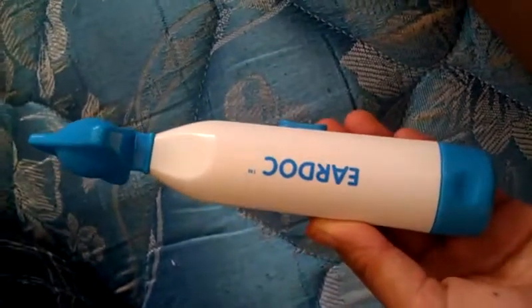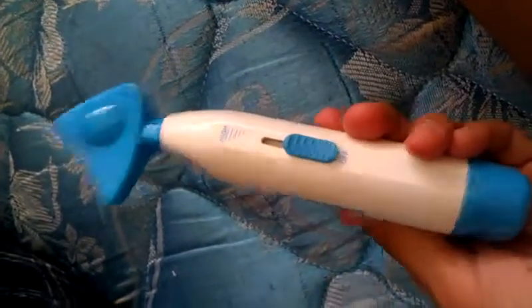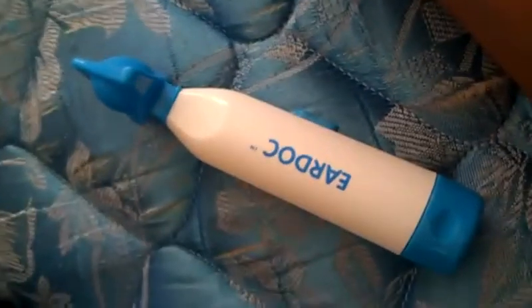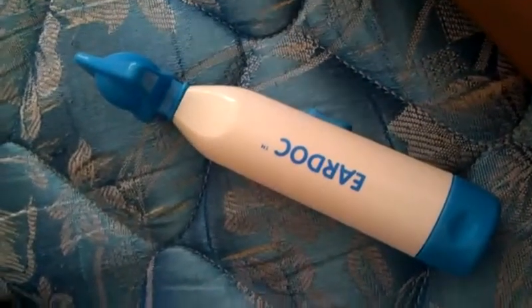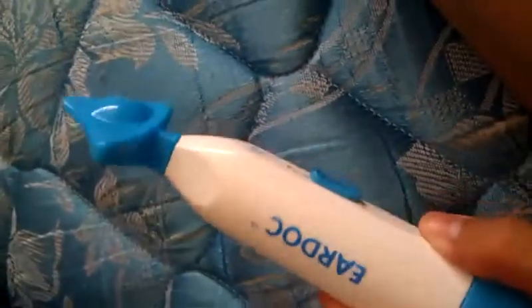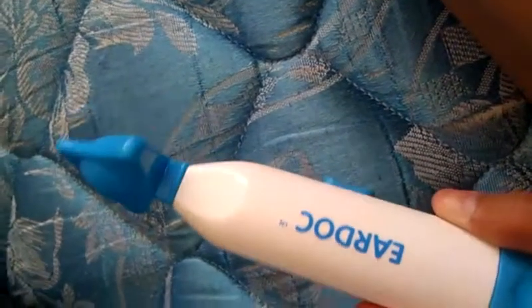Here's my review for the EarDoc. I know it looks a little weird, but we like to believe that it works. It's good for swimmer's ear, great for use on the airplane, and for divers too. It's used to relieve the trapped fluids and gas in your middle ear.